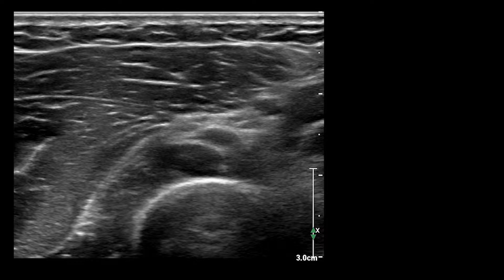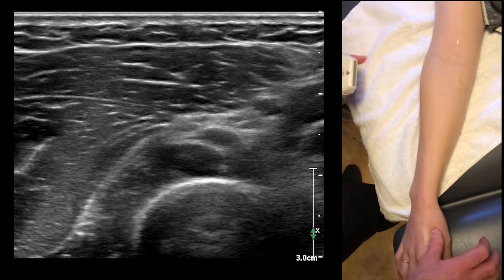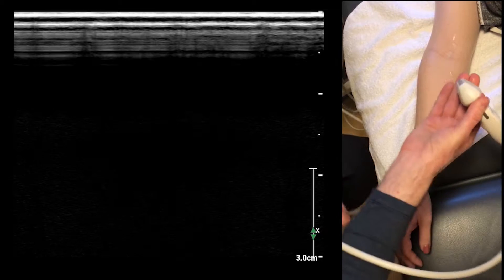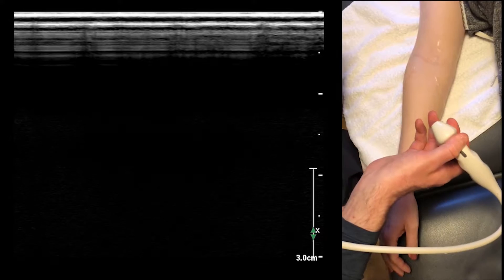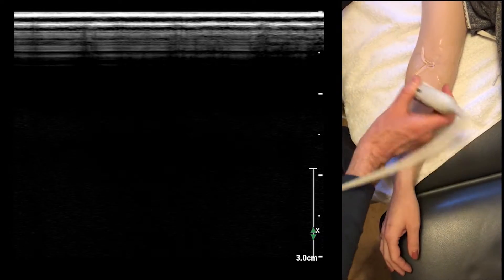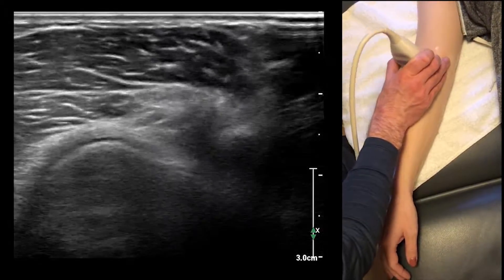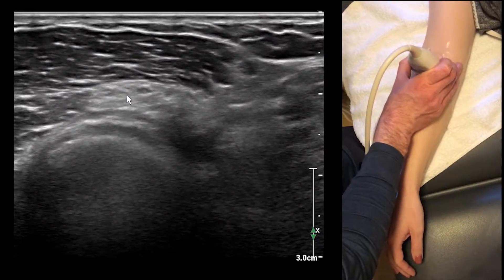What I like to do here is have the wrist in pronation, and what that does is it helps give us access to the supinator and the superficial radial nerve. Here's the radial nerve here.